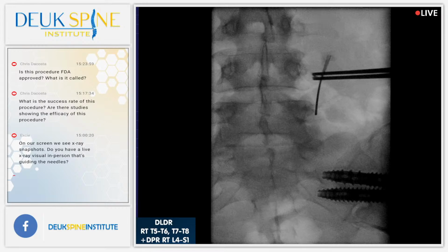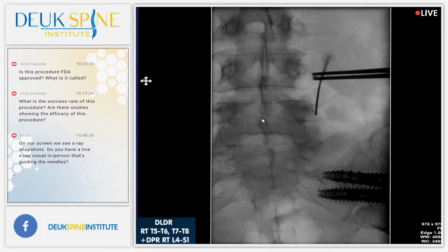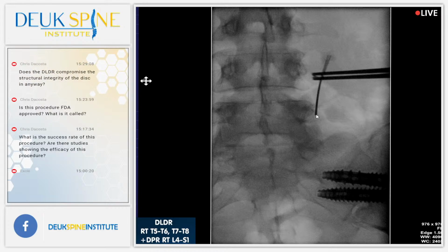Shot. Okay, see where the tip of that needle is, guys? Point to it. Go ahead. That is exactly where you want to be. You see the transverse process? Show them the TP. That's the transverse process sticking out, and it comes back and attaches to the superior facet right where the pedicle is, the top outside corner of the pedicle. So right where those meet, that's where we want to be. That's where the pain nerve lives, and that's our target, the medial branch of the dorsal ramus.